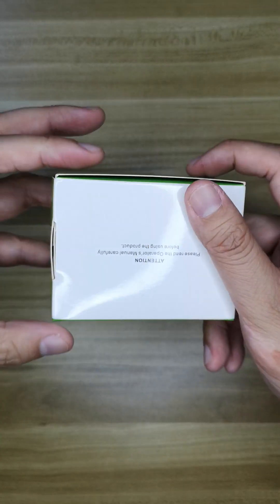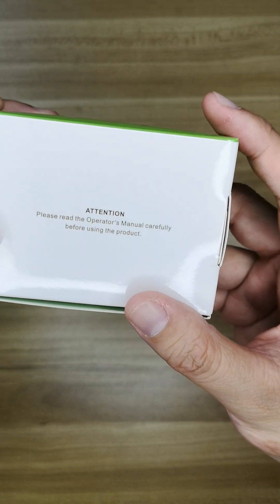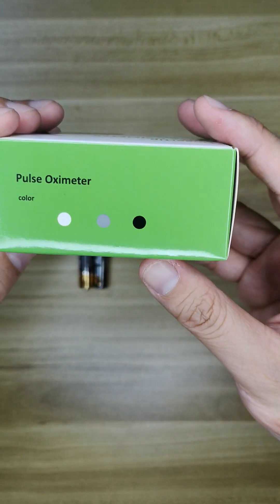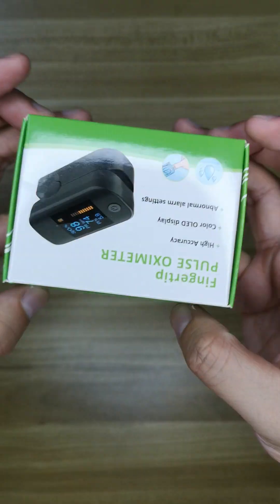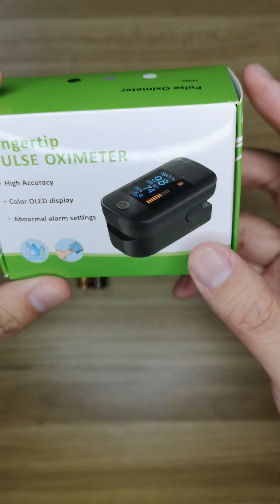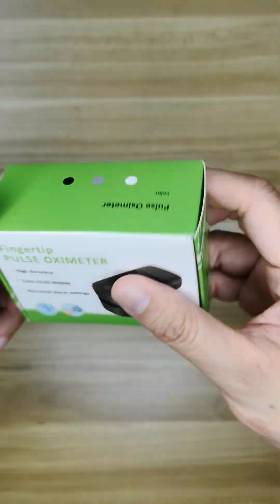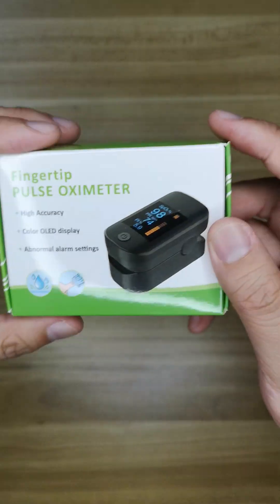Here is the package. Please read the operator's manual carefully before using the product. This color is black, and this is our pulse oximeter. Right now COVID is spread all over the world, and this is very useful for your health.